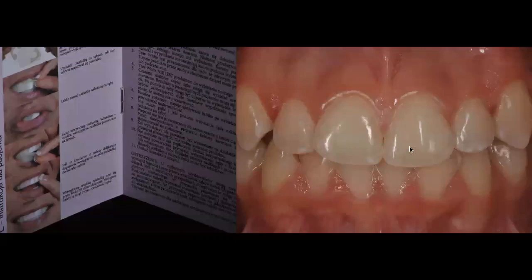This is my young patient. This is maybe 2 or 3 days after she started. She called me, and I actually had her come down because I wanted to see how bad it was, because it was painful, and you can see how irritated the tissue was, literally bleeding. You can see this papilla here and this papilla here getting a little bit of the hydrogen peroxide as well.